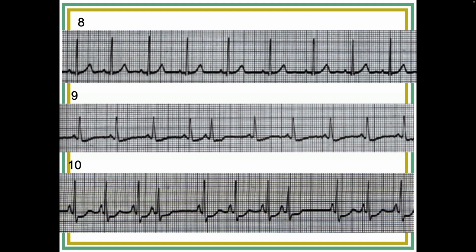Natalie? I also like the boxes method, so I got about 95 beats per minute. And we're on number 10 right now. This is the premature and that's premature. So normal sinus, normal sinus, with premature. Excellent. And it's so close to 100 that if you put borderline sinus tach or sinus tach, I'm okay. But I agree with the 95.